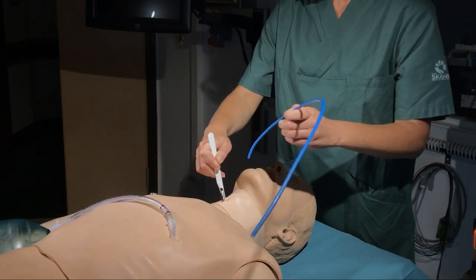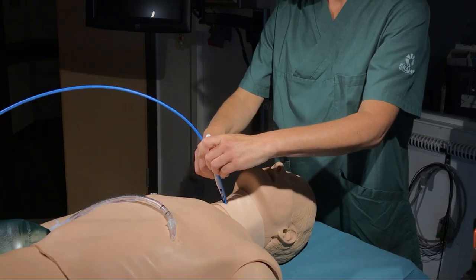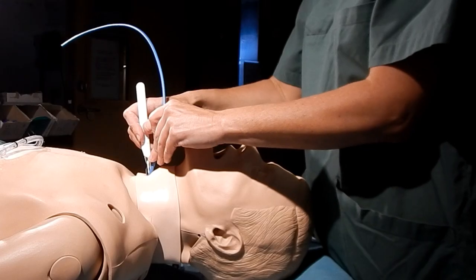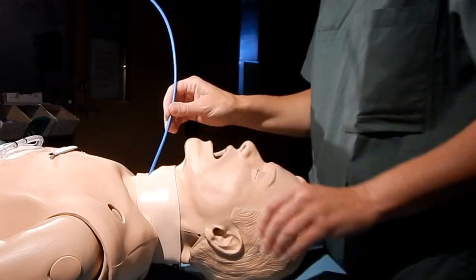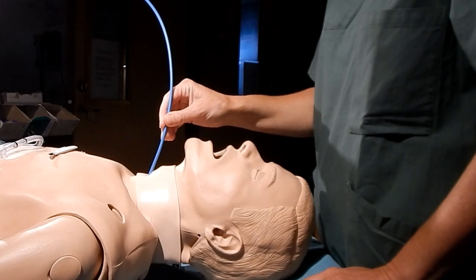Then take the bougie and slide the tip down the scalpel blade into the trachea. The bougie should move freely. Now remove the scalpel and confirm once again that the bougie moves freely. If it's a hollow core bougie, it's possible to oxygenate at this stage.